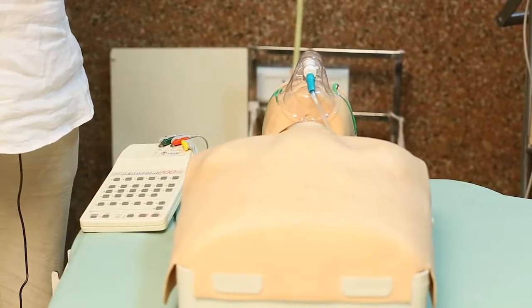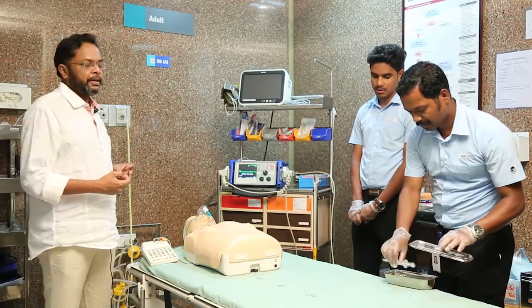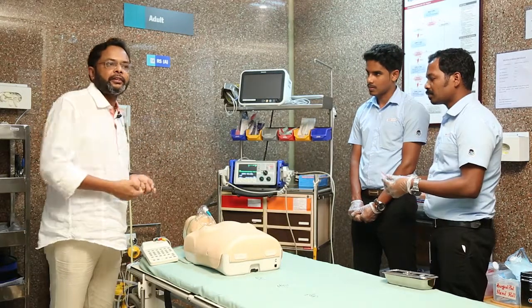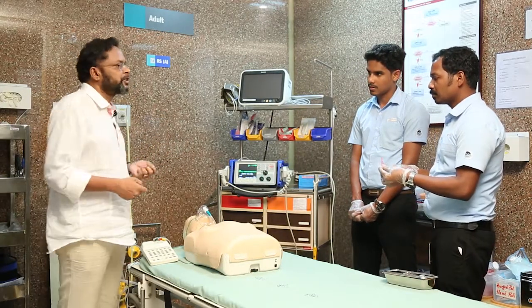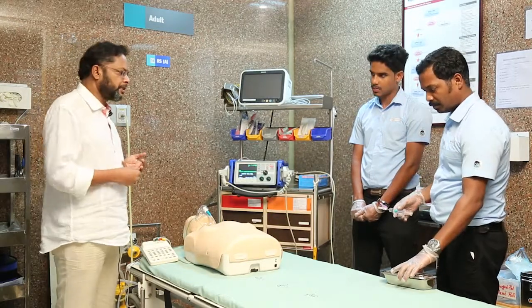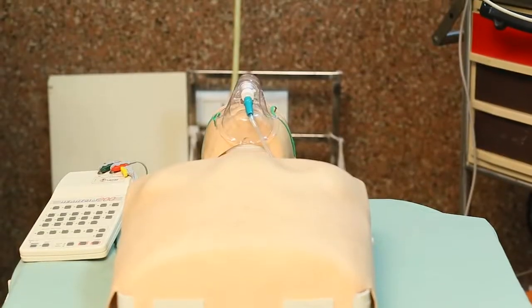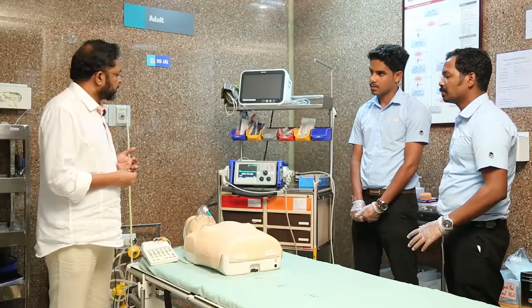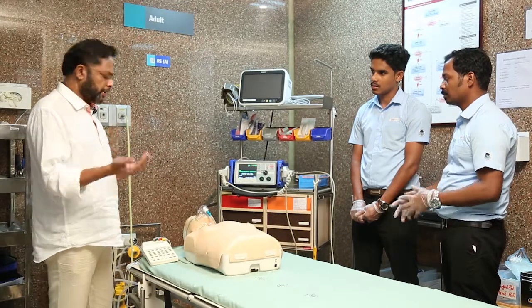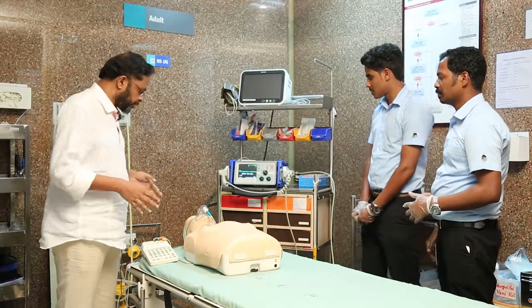We must give adequate sedation because passing a current into someone's body is painful and very uncomfortable. We can use midazolam or an opioid, depending on your institution's policy. Once sedation is given, we proceed with the cardioversion.